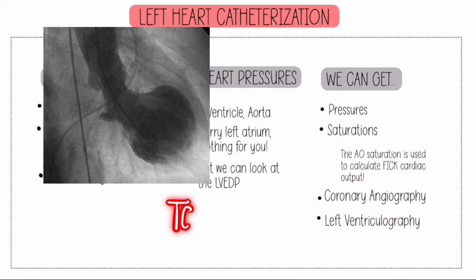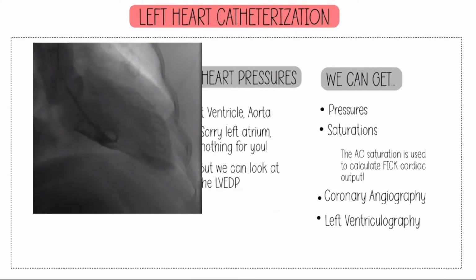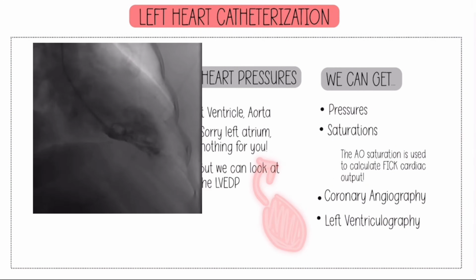So if you've heard of broken heart syndrome before, where you have a really, really low cardiac output, you start to get this disconnect in the way that your left ventricle is contracting, which is why you're getting that low cardiac output, usually stress-induced, catecholamine-induced. We can take an LV-gram to assess for that. And then what you're checking for is, like I just said, the cardiac output by estimating what the ejection fraction is. How much of that volume of contrast that you injected into the left ventricle is ejecting out into the aorta. That gives you a good idea of how that left-sided function is doing.